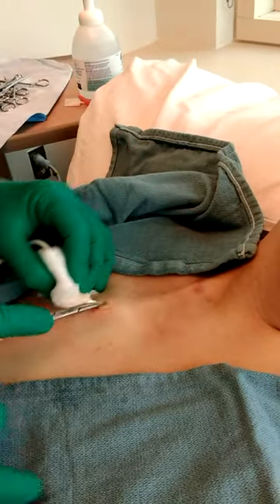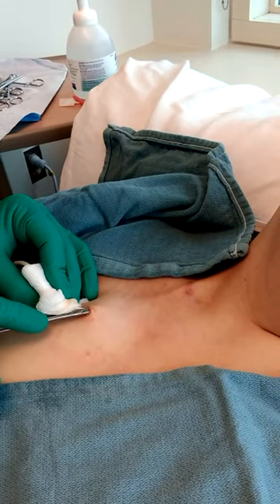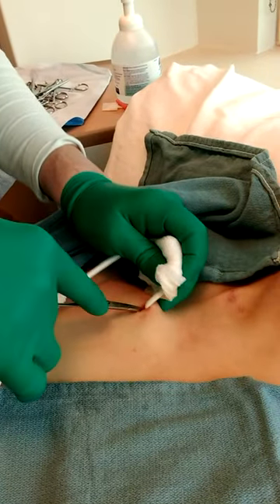Sometimes, literally, all it takes is one thread of skin to hold this thing on. Because it's attached. The longer they're in there, the worse they are to come out.